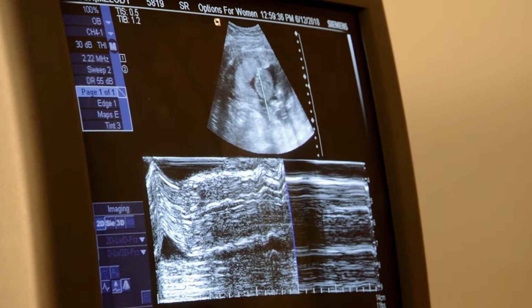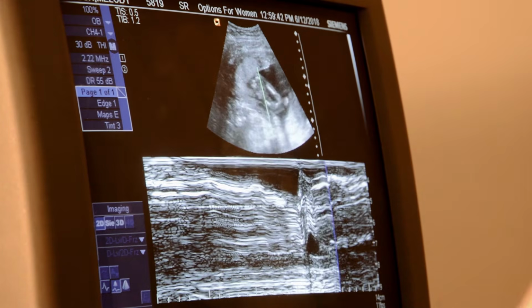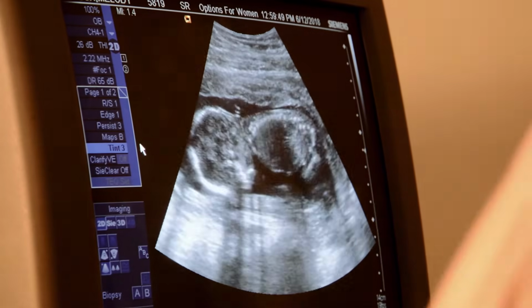And now the baby decides to move on me. So it's not a good time for a heartbeat. So let's go out of the heart. And let's go see what this guy's doing. When they start moving, it's playtime.